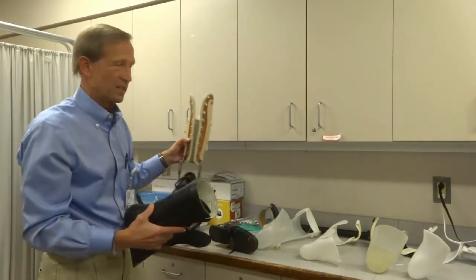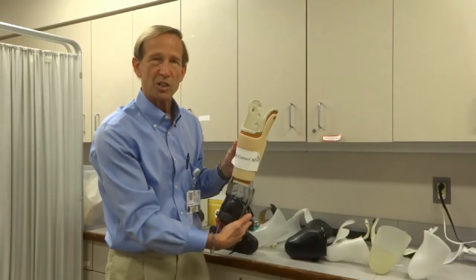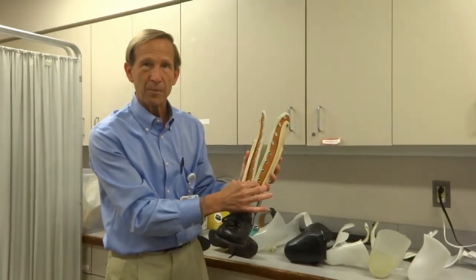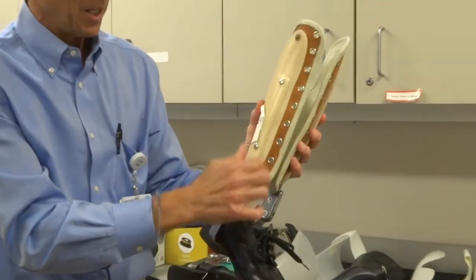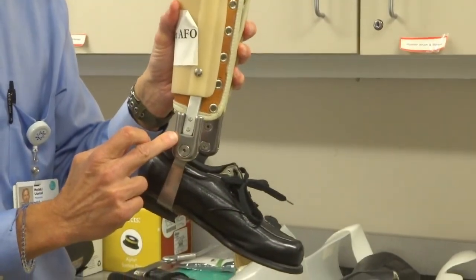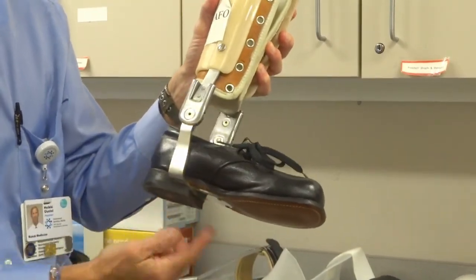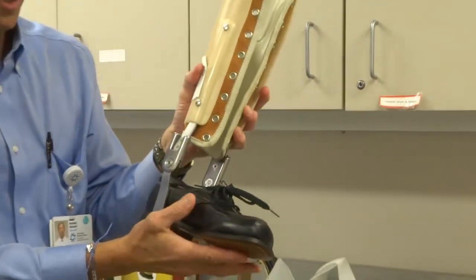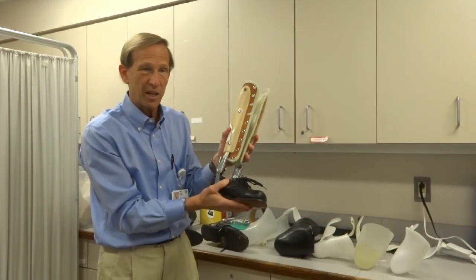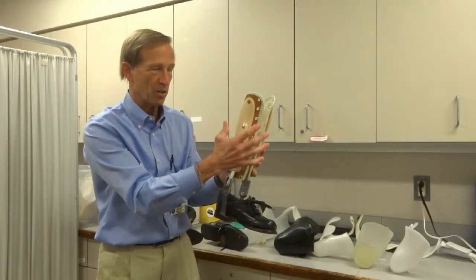We have another version that's a bit heavier but performs the same function — called a calf corset AFO. It works essentially like a corset for your calf, tightening with laces or Velcro, and transfers the weight through metal bars down to a two-channel ankle joint that can lock the ankle in any position, connected to that metal stirrup attached to the shoe. This allows us to set and immobilize the ankle position anywhere we want, bypassing the foot and ankle by transferring load up to the calf.